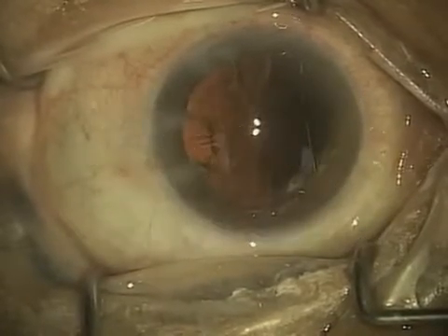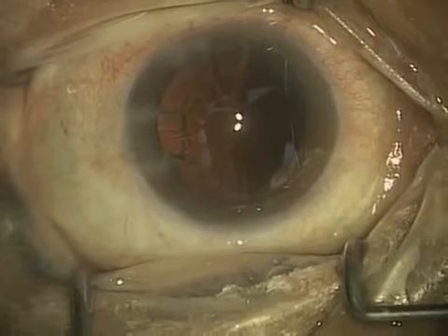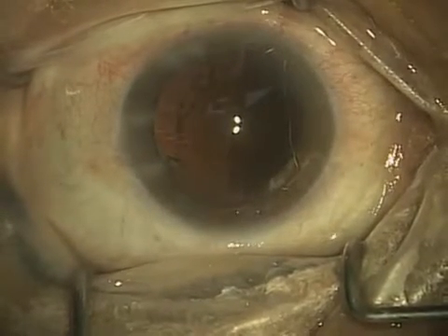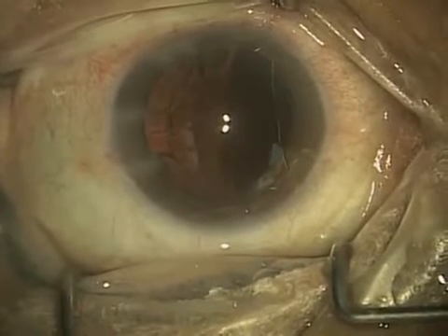Now you'll notice it's pretty clear except for over on the side, where you see there's a little bit of haze. That's what we call the cortical material, and in a second you'll see that I start removing that with two instruments.